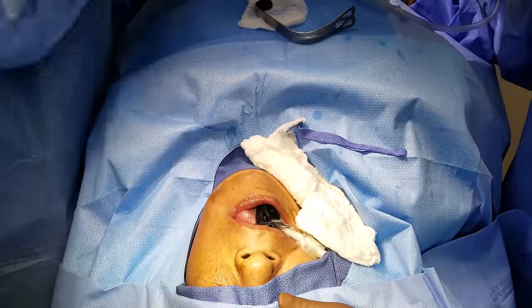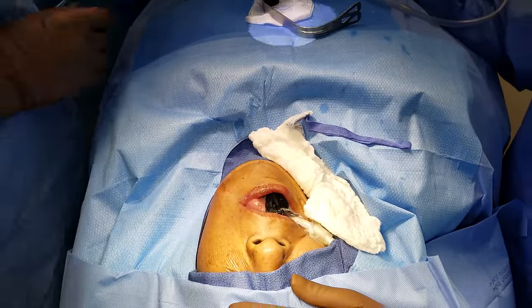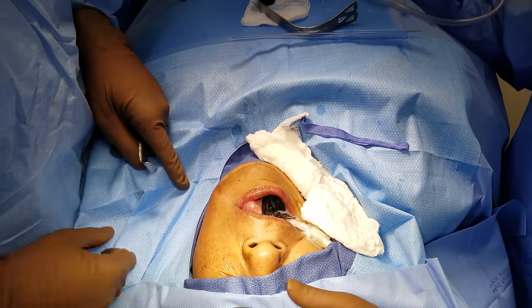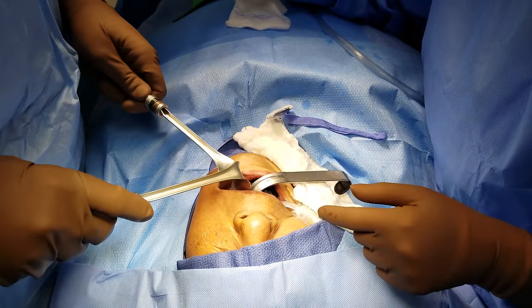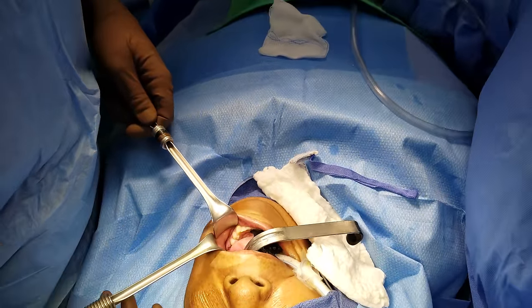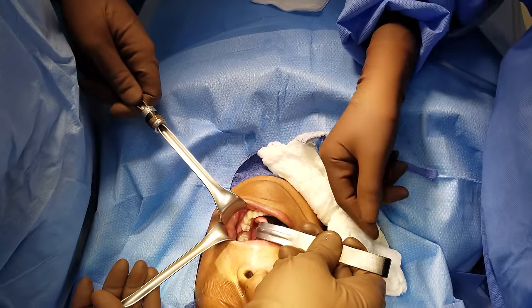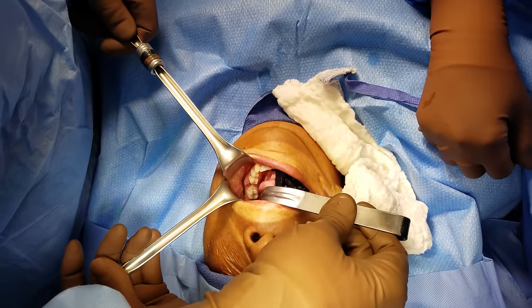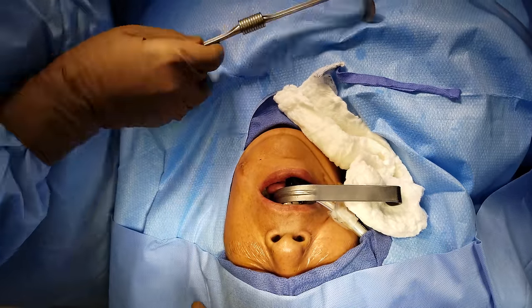All right, get suction. Can you connect the suction, please? Can you deposit for a second? I'm just going to make sure. Just hold that, and then, oh yeah, film that. It's all pus leaking out of there. Now, let's do the drainage out here. Thank you.